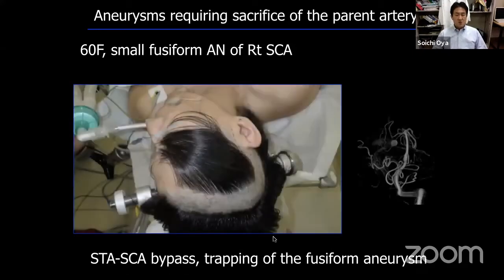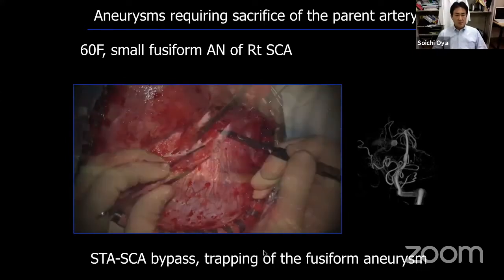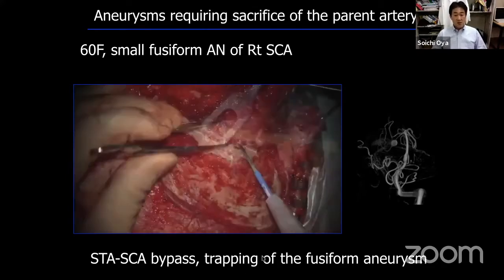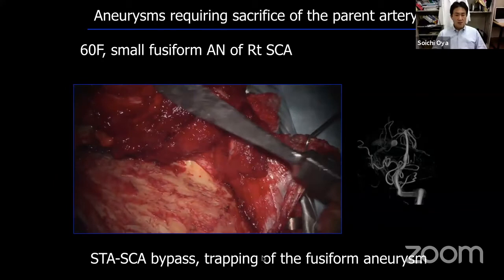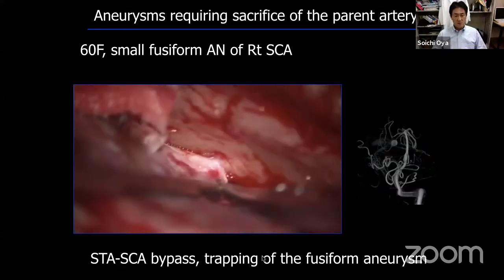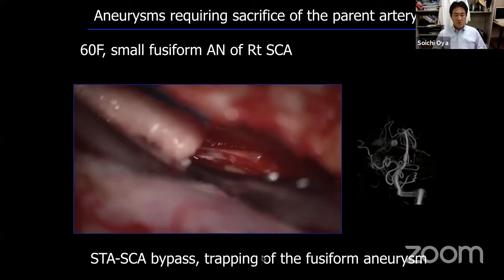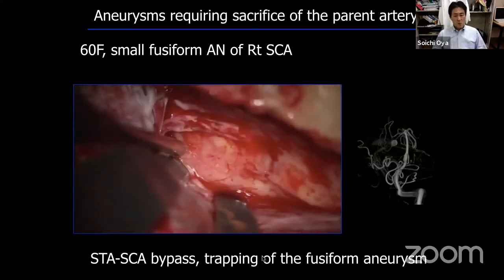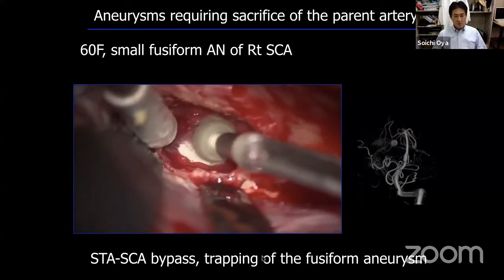The patient was placed in the supine position and her neck was rotated to the left. This is a two-layer dissection with a transzygomatic approach, and the temporal muscle was reflected as low as possible. This is the supramastoid crest, which corresponds to the height of the tegmen of the temporal bone. This is the facial hiatus and the GSPN. I'm checking the course of the facial nerve by facial nerve stimulation. And this is the so-called Kawase's rhomboid. Now I'm drilling the Kawase's rhomboid.